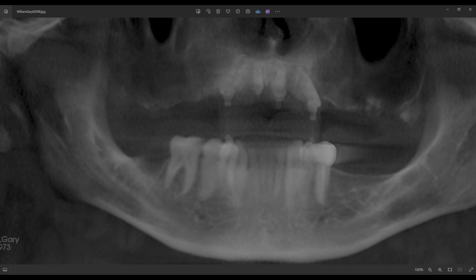And so, actually, I'll let you take over here, Dr. Koo. There are a lot of patients like this, and we're going to show you 3 examples coming up of patients we've seen recently that have this issue, that just have large sinuses. So, can they get all-on-4 dental implants? What is the solution for that? For sure. Dr. Choi briefly went over the concept of a cantilever. In a situation like this, if we want to minimize a cantilever, there are several options.